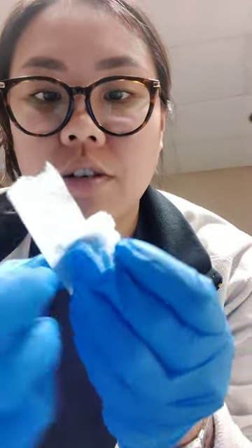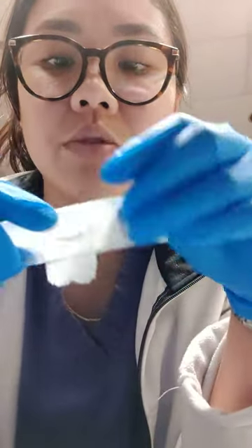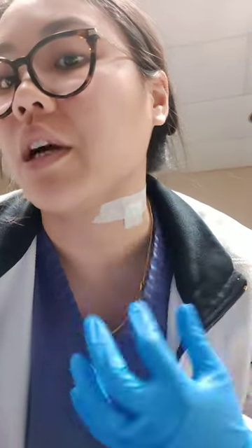And then I'll just get another piece like so. And then I'll just tape it on that. So why do we use this? It's good reference points for the radiologist. Let's say there's like a nodule here or something like that that needs to be marked. So you just put it and then you mark it there.